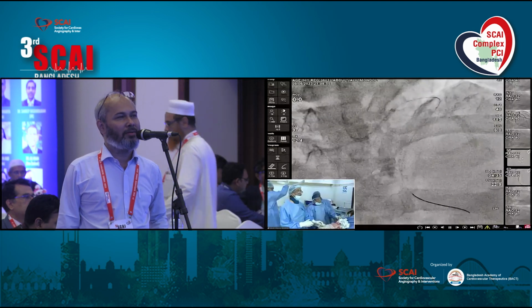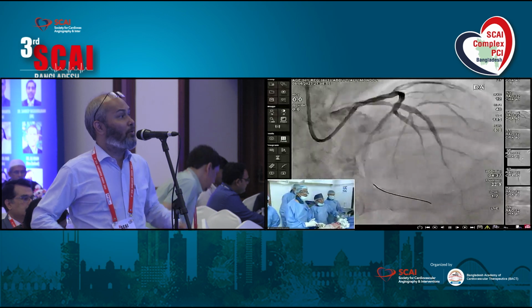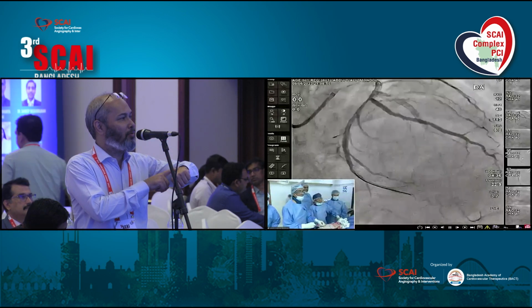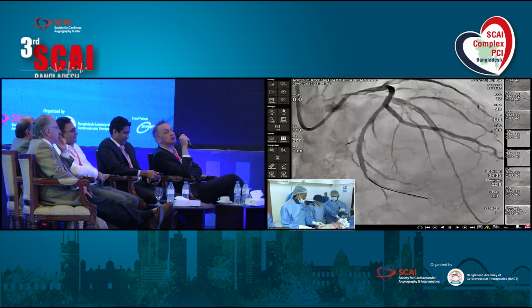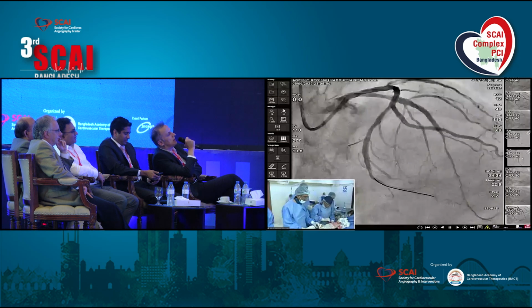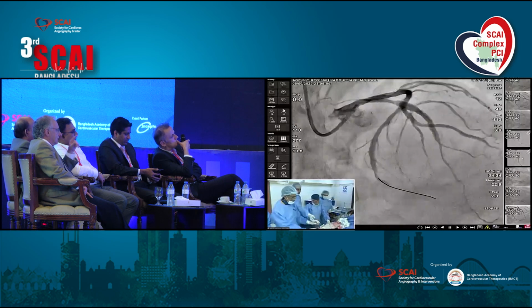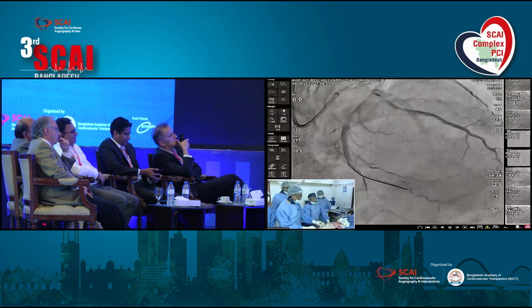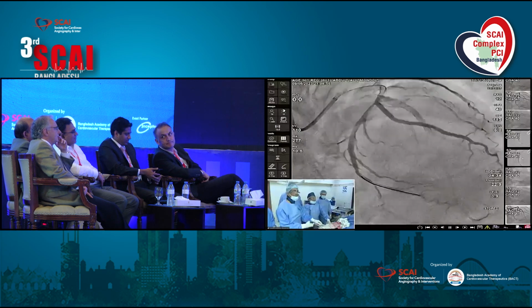Okay, fine. I think it would be good to have IVUS rather than stent boost, because I don't have any time, you know. No, we have another minute. This is important. I'd like to see it again. I think it seems to be pretty good, right? Angiographically it looks better, but how about IVUS? Now, do you want to see IVUS? Yes, please. Omar is interested to see the IVUS.